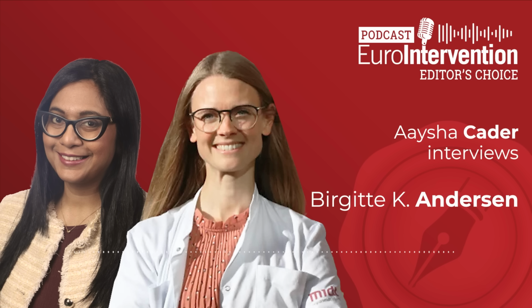But some research focusing on when angio-based physiology is appropriate and when we can rely on it, because maybe it's most appropriate in more simple coronary lesions with good visualization, and maybe we can do it in 50%. But we still need to have some personnel that are trained in doing it, and they need to be working that day. And so the cost effectiveness, the reproducibility, the image quality, the different populations and lesion-specific pitfalls, I would say, are important.